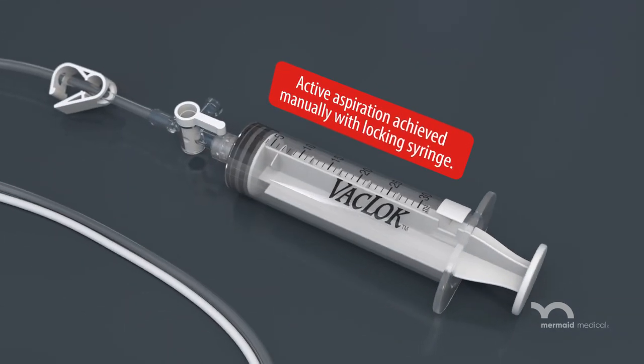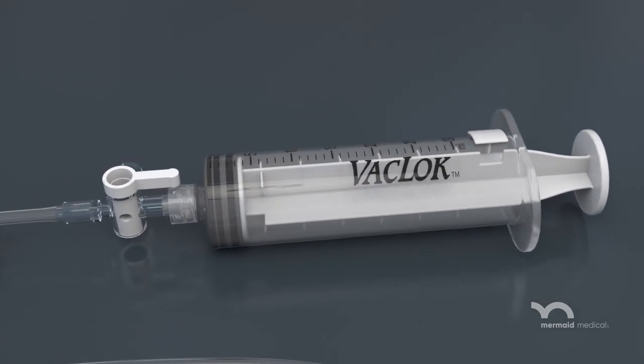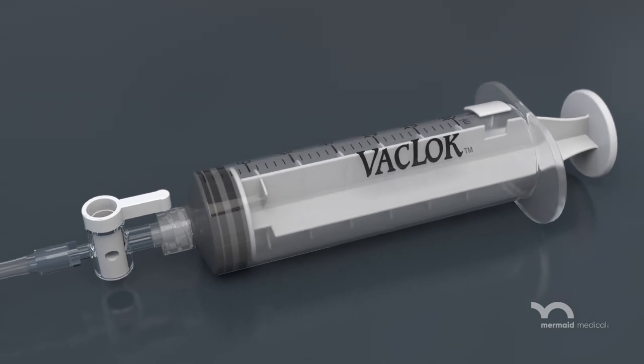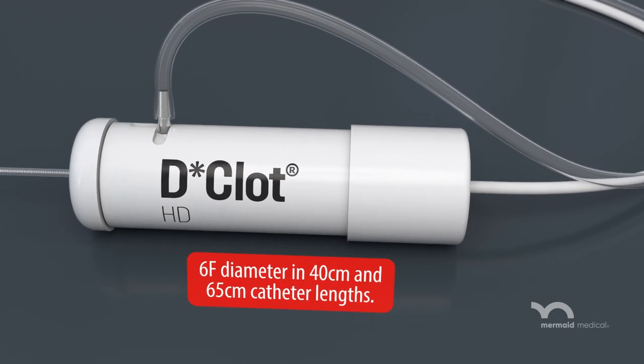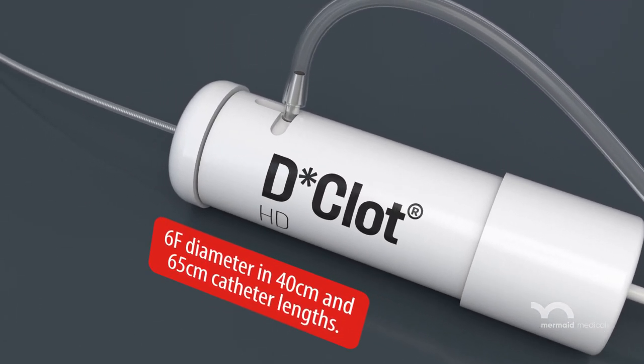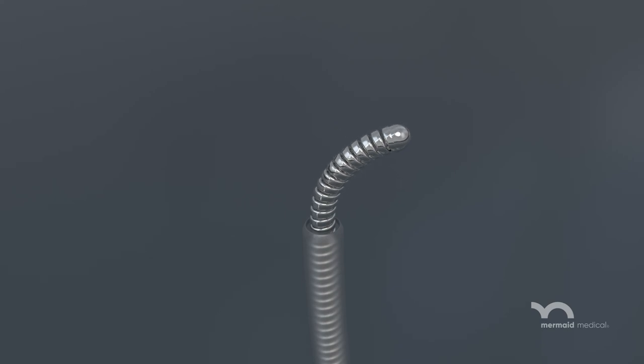A 30 cc locking syringe provides active aspiration to aid in thrombus maceration and removal of thrombus debris while limiting blood loss. The Declot HD is available in 6 French by 40 cm or 65 cm catheter lengths. The rotating spiral shaft has a stainless steel distal tip that provides vessel wall contact up to 10 mm.